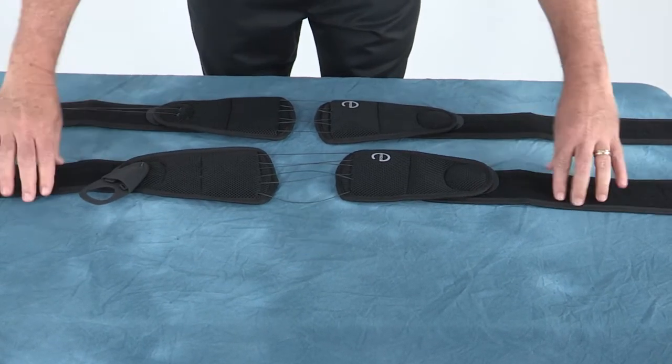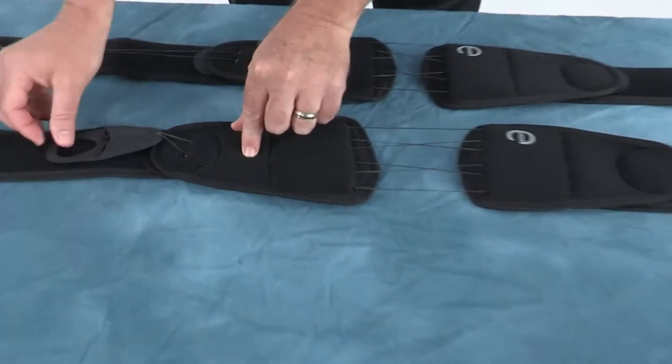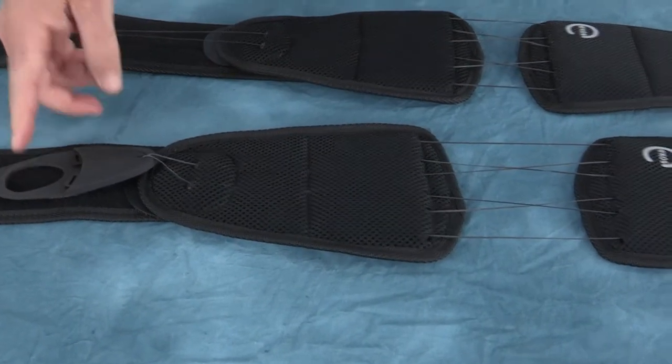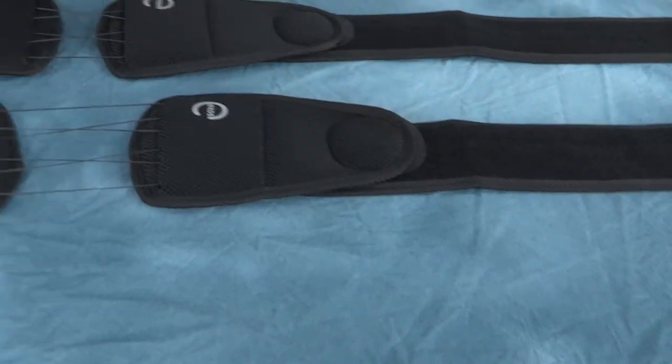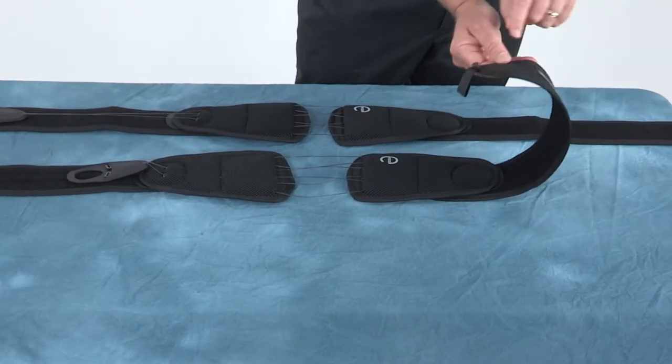Reattach the pull tab to the belt wing. The brace may be oriented so that the patient can pull the tab from either the right or left-hand side. However, the pull tab should be positioned on the opposite side of the belt wing with the hook attachment.